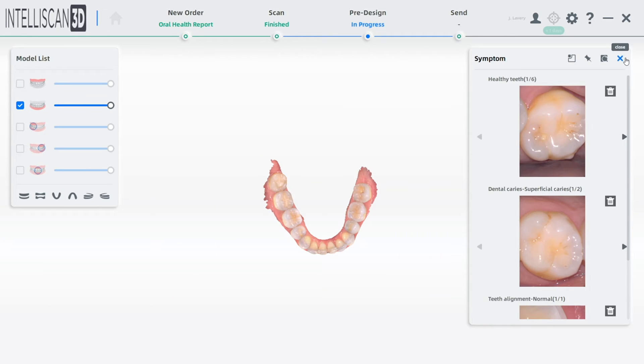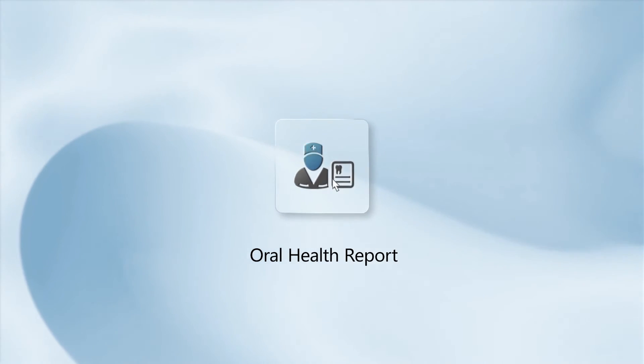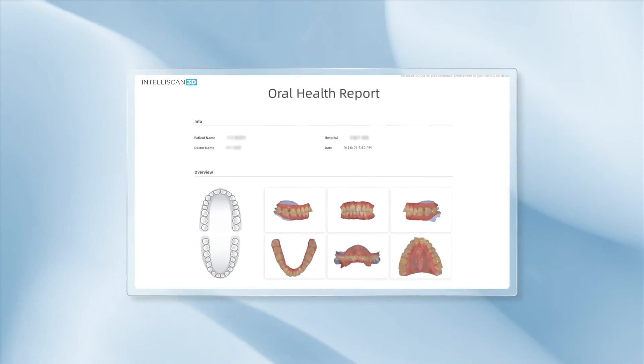IntelliScan Model X will organize your photos and notes and print a report for your patients so that they can walk out with your recommendations in a clear, non-confusing report with photos to motivate your patients to say yes to the best.